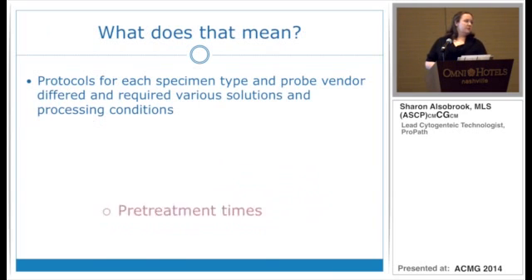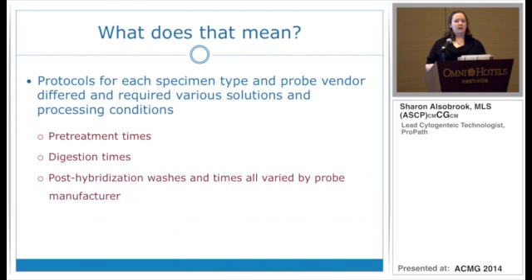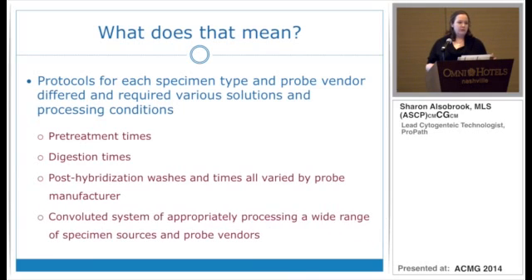So we have all these different specimen types coming in from multiple different places around the country and around the world with whatever conditions they have in their lab established before they send them to us. This means that for every specimen type, there's going to be a variation in the digestion times, pre-treatment times, and then also the vendor of probe that we use for FISH determines the melt and hybridization temperature and time. So this comes together to form a very convoluted system for every specimen type, for every location it's coming from. In combination with all the multiple different probe vendors, we have a very convoluted system that we have to keep track of for every specimen.